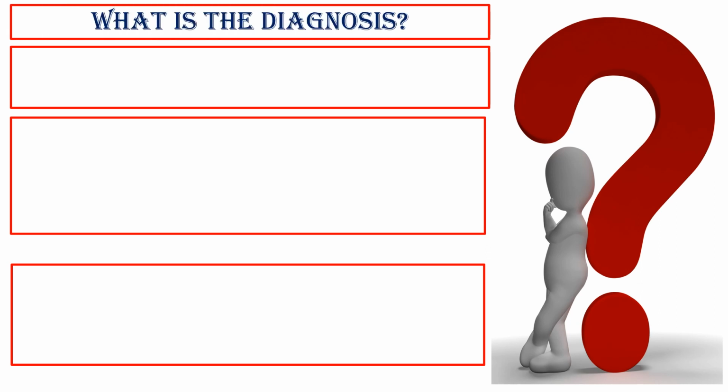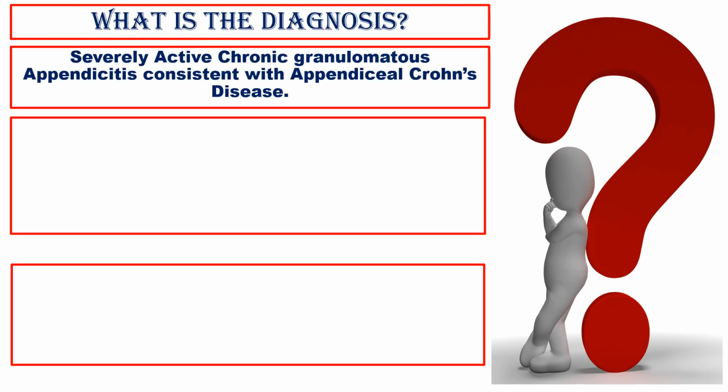Okay, what is the diagnosis? Severely active chronic granulomatous appendicitis, consistent with appendiceal Crohn's disease.